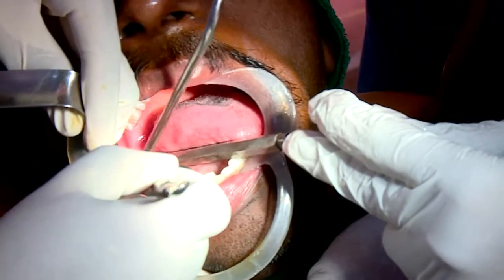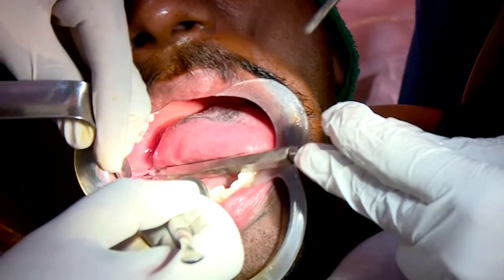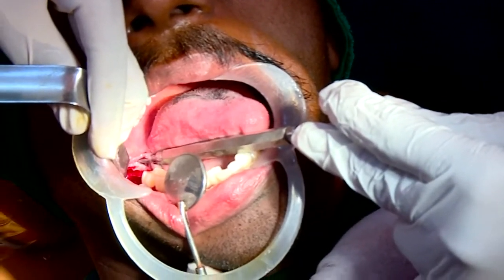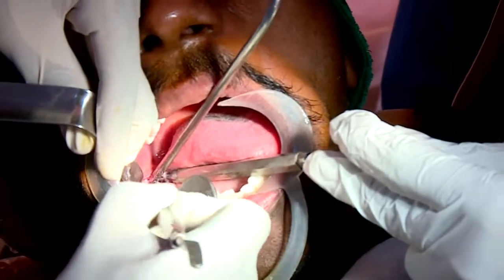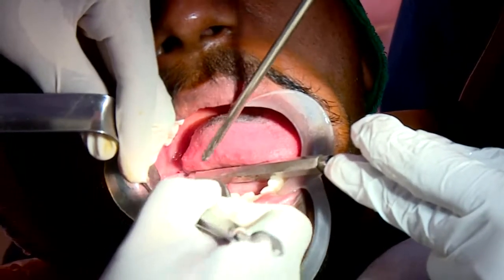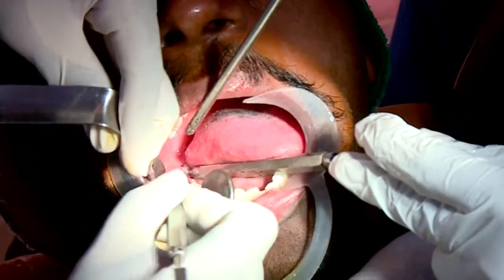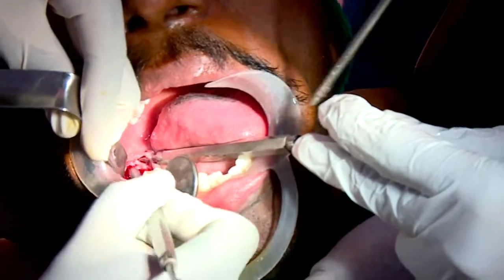With a few irregular parts of bone remaining, the next procedure will be filing it using a bone file, just to smoothen all the sharp bone. It is usually done in a unidirectional motion, to remove all the sharp bone.